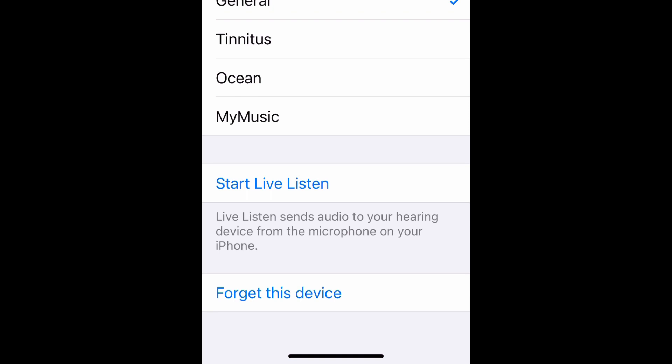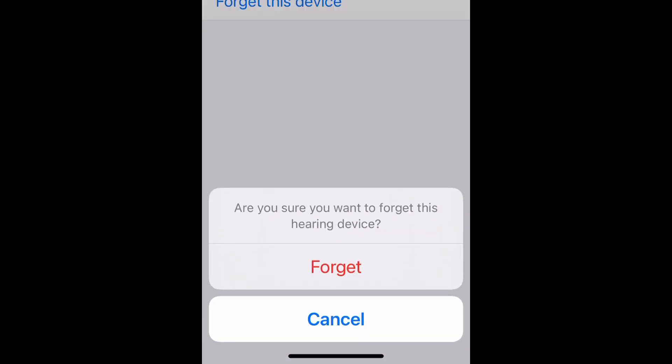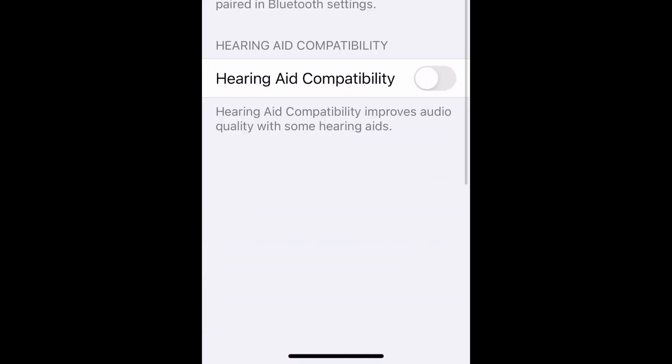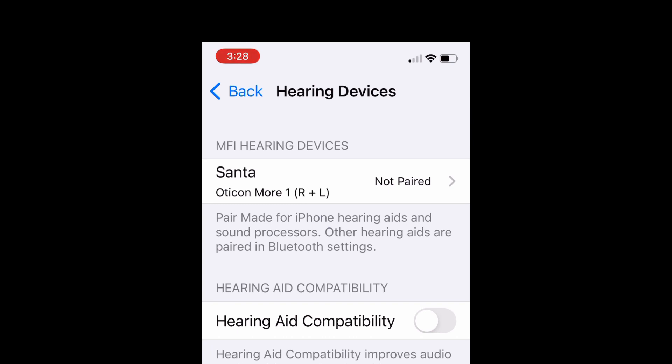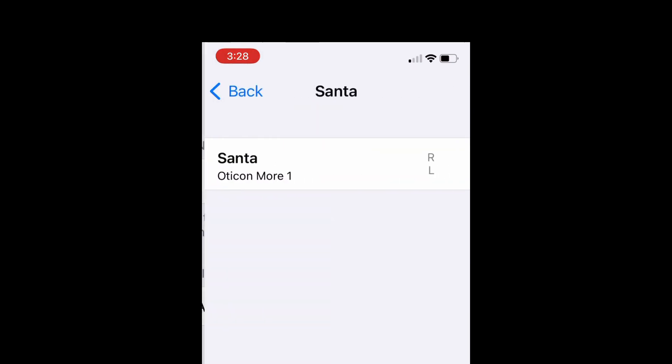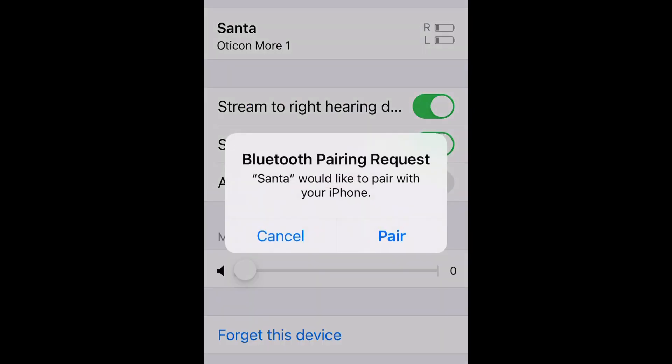Once it's forgot the devices, you can go ahead and close the battery doors on your hearing aids or pull them out of the charger. It will search for them. When it finds them, click on them, and then it will prompt you to pair the hearing aid. What you want to do is click on the pair button, and it'll do that for each hearing aid — pair and pair.